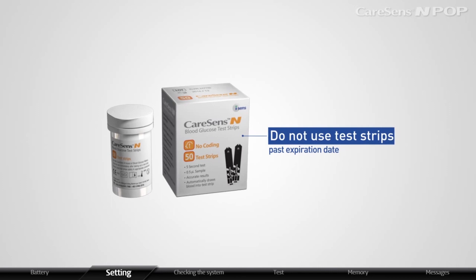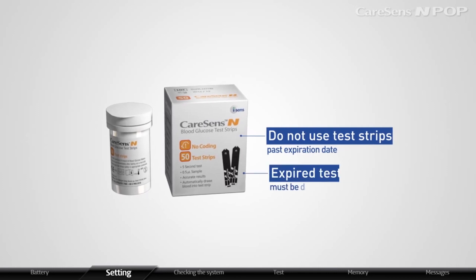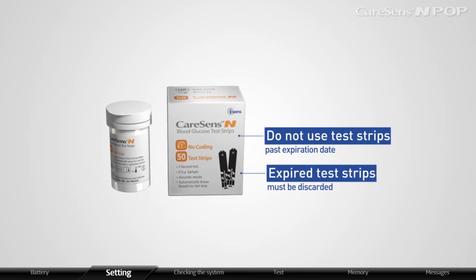Do not use test strips past their expiration date. Expired test strips must be discarded.